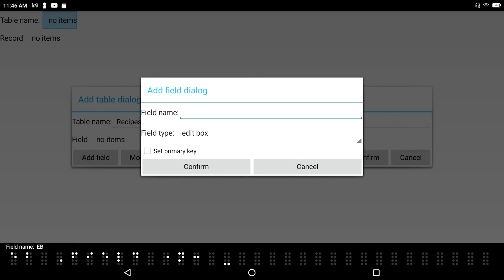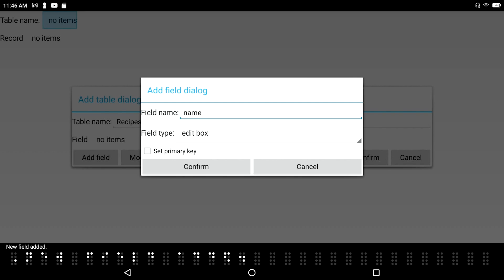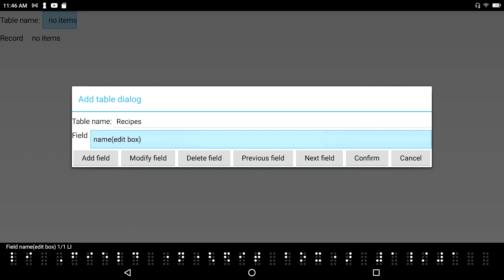Field name edit box. Let's call this one 'name' — we want to know what we're cooking here. I typed it in contracted Braille followed by enter. New field added. Field name edit box, 1 of 1 list item.